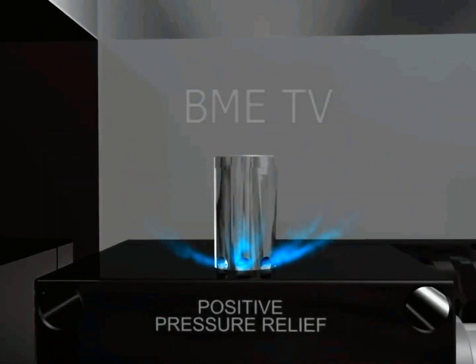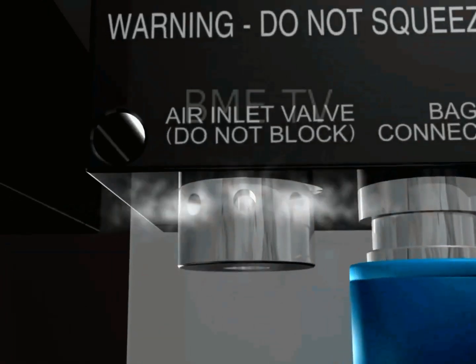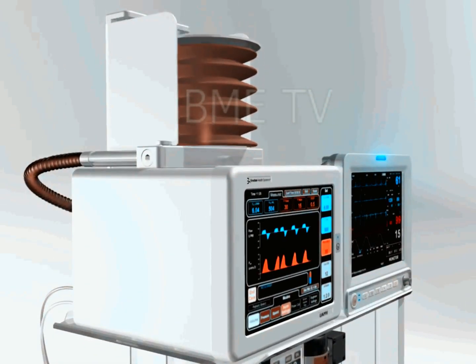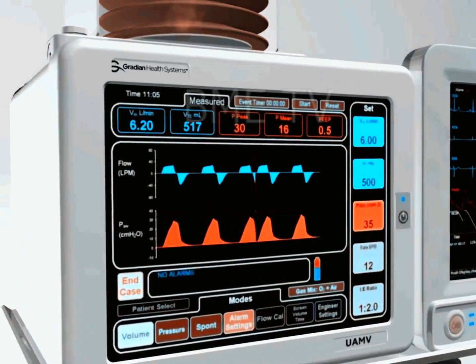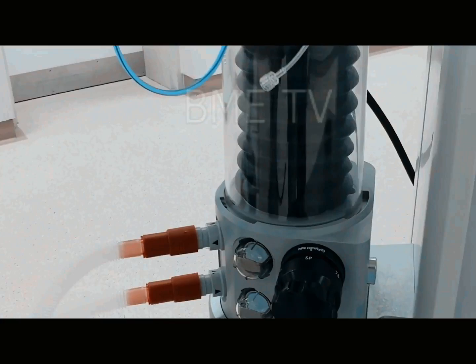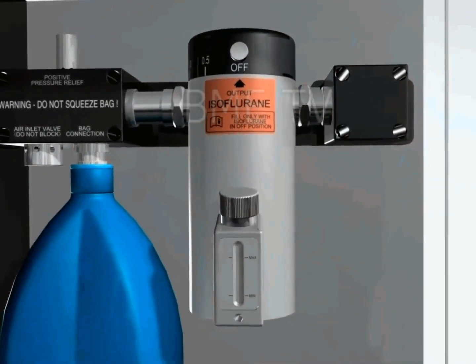per minute. Systems for monitoring the gases being administered to and exhaled by the patient, including an oxygen failure warning device. Systems for monitoring the patient's heart rate, ECG, blood pressure, and oxygen saturation may be incorporated, in some cases with additional options for monitoring end-tidal carbon dioxide and temperature. Breathing systems are also typically incorporated, including a manual reservoir bag for ventilation in combination with an adjustable pressure-limiting valve, as well as an integrated mechanical ventilator to accurately ventilate the patient during anesthesia.